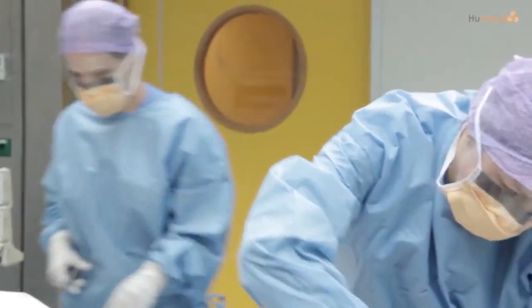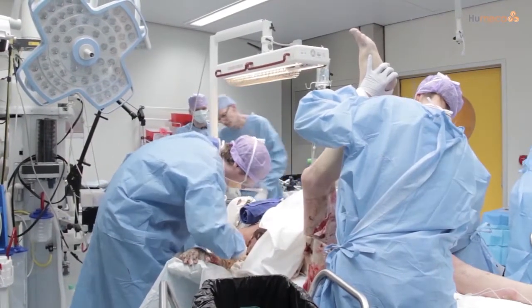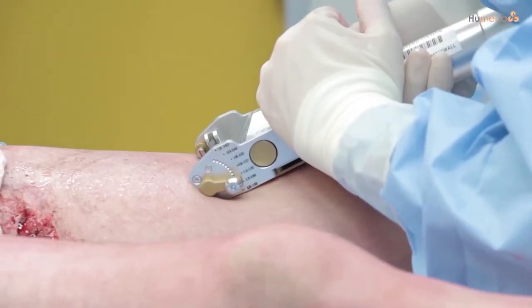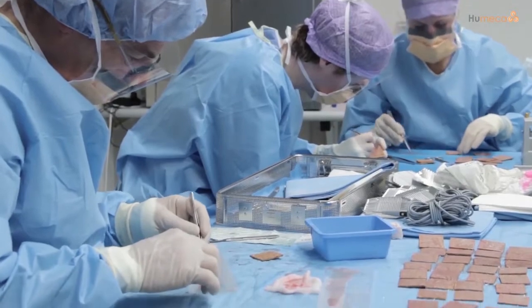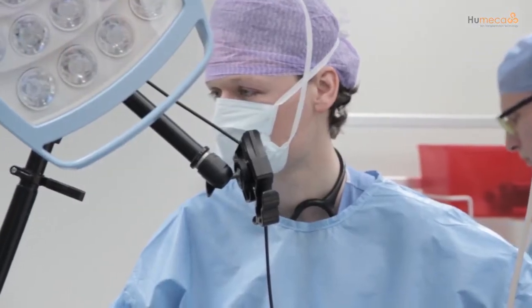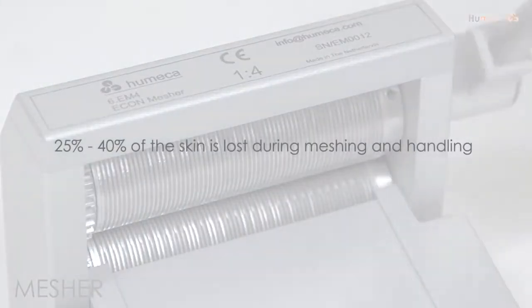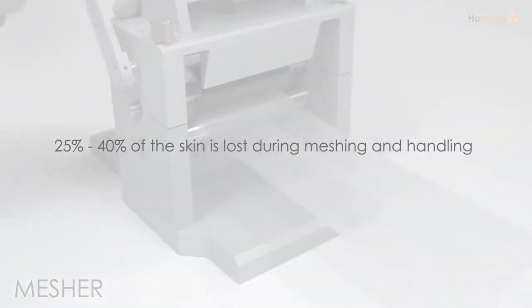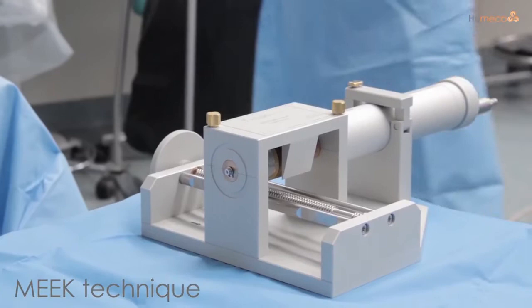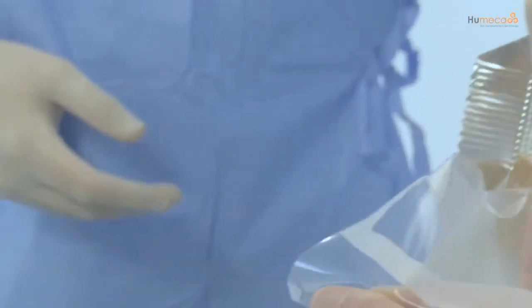All burn surgeons worldwide face the same problems in treating severe burn wounds, such as limited donor sites and difficulty in handling widely meshed skin grafts, especially when expansion ratios of 1 to 3 and higher are required. The expansion ratios of these mesh grafts are not realistic because 25 to 40 percent is lost during meshing and handling. We are proud to be the exclusive supplier of the modified Meek technique, the solution to all of these problems.